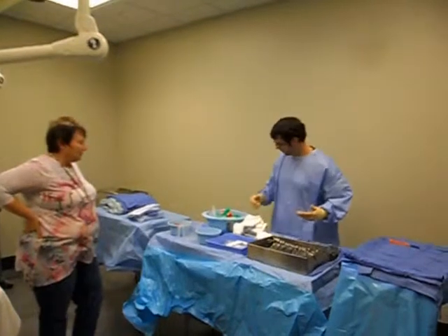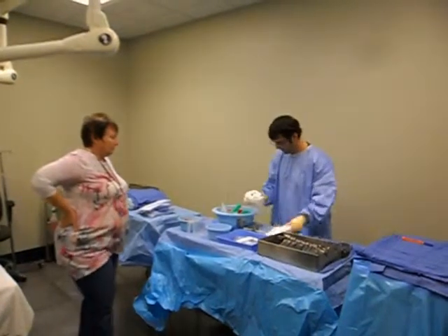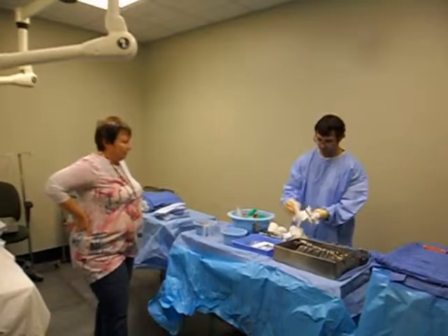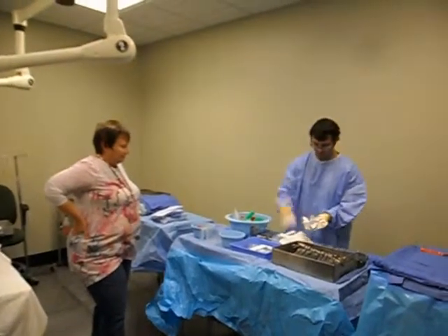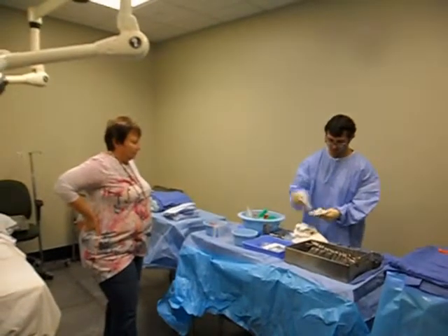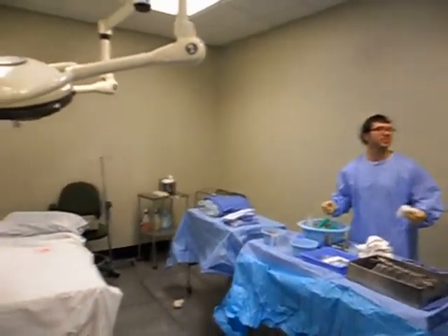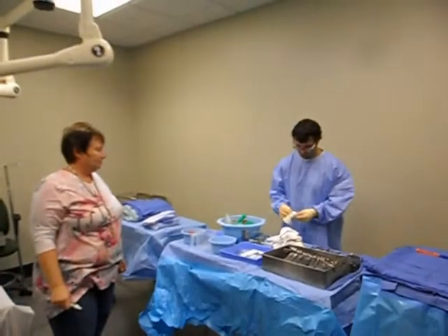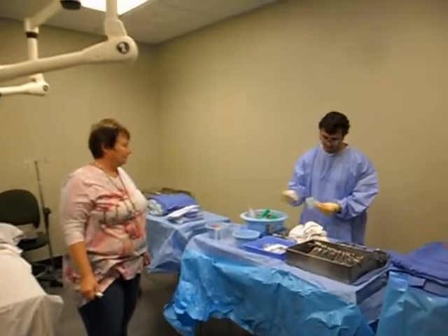All right, now you wanna count? Sponges, this wouldn't have anything. My laps are kinda hanging out, there'd be 5. I'd show you, break it. 1, 2, 3, 4, 5, break it. 1, 2, 3, 4, 5. It's 10. So I'm gonna mark that down as you have laps, you have 10. What do you have for longs? 1, 2, 3, 4, 5, 6, 7, 8, 9, 10.